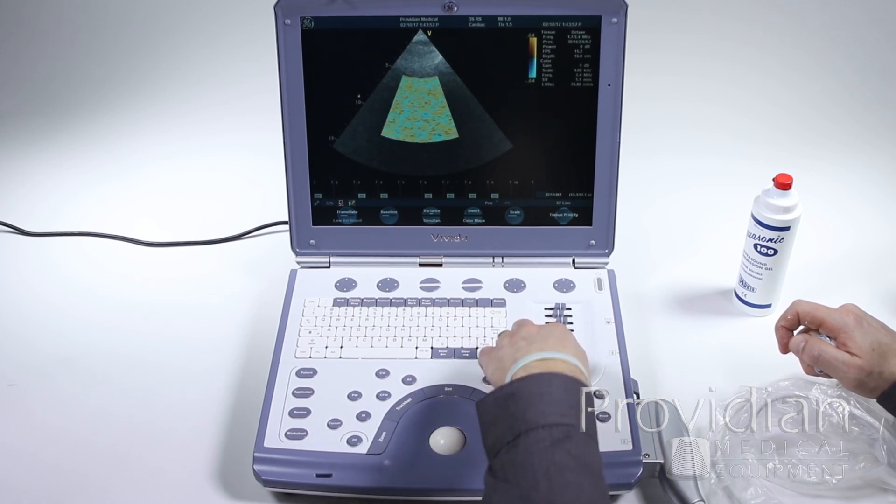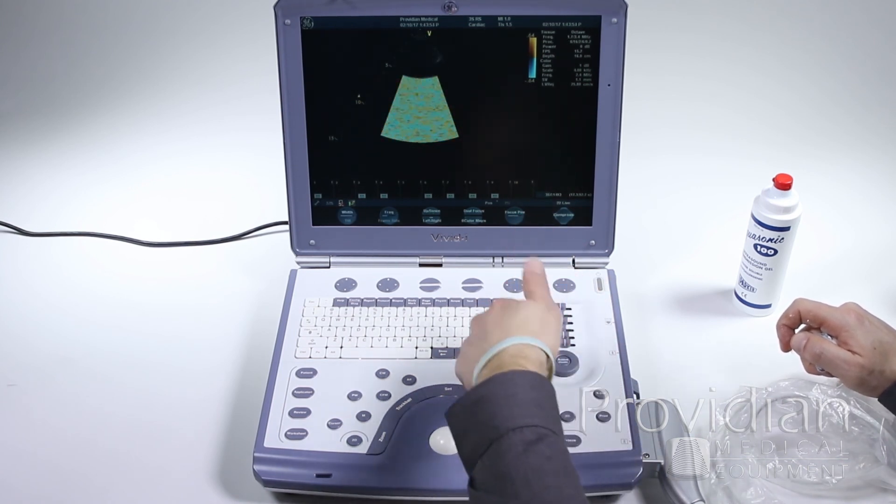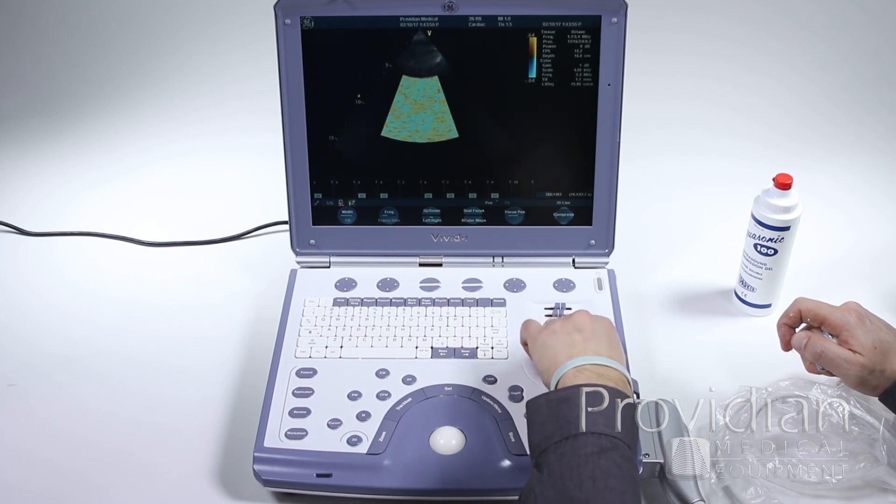You have your gain. I can press active mode. So if I push active mode down, it's going to change the 2D image. If I push it again, it's going to change the gain of the color image.